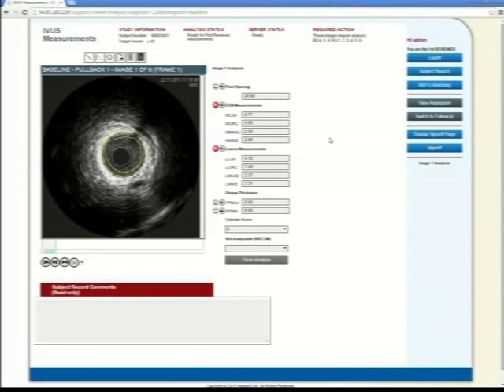And so these are flagged, and then once they sign off, it goes back to the first reviewer. Got it. And so it goes into their queue. They can come back and make those corrections. Okay? And then the final step is a physician reviewer. So the physician will sign in, because that's in their queue now. Right. They'll sign into this case, they'll review it, and if they agree with everything, great. If they disagree with a particular image, they can annotate as well. That eventually goes back to the first reviewer. Again, they're the ones that own it.